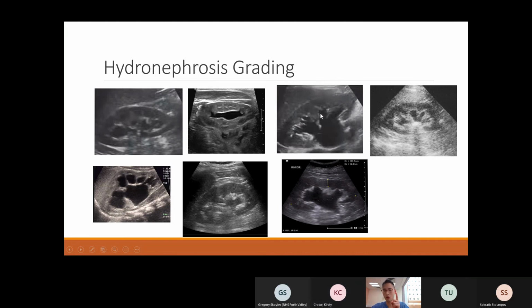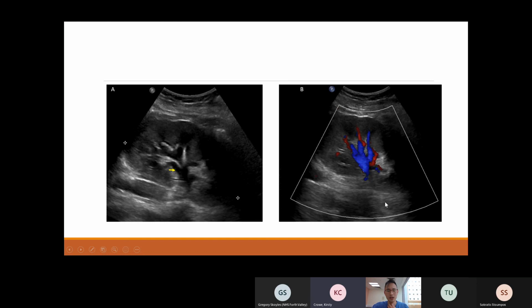Same here. They're all interconnected. If you've got various bits that seem to be walled off, you should think about other things like intercurrent cysts or something else. Okay, they have to be interconnected was the word I'm looking for. I didn't know where I said intercurrent. Sorry, interconnected. Okay.